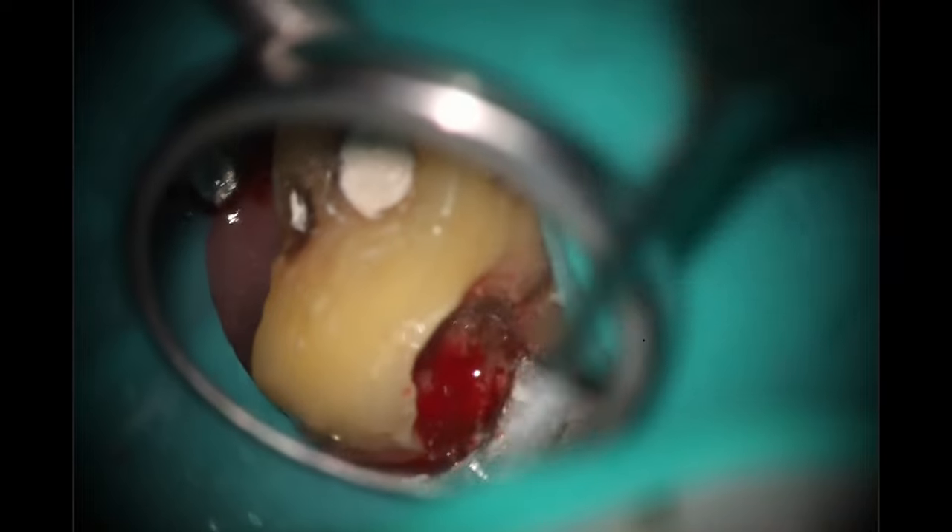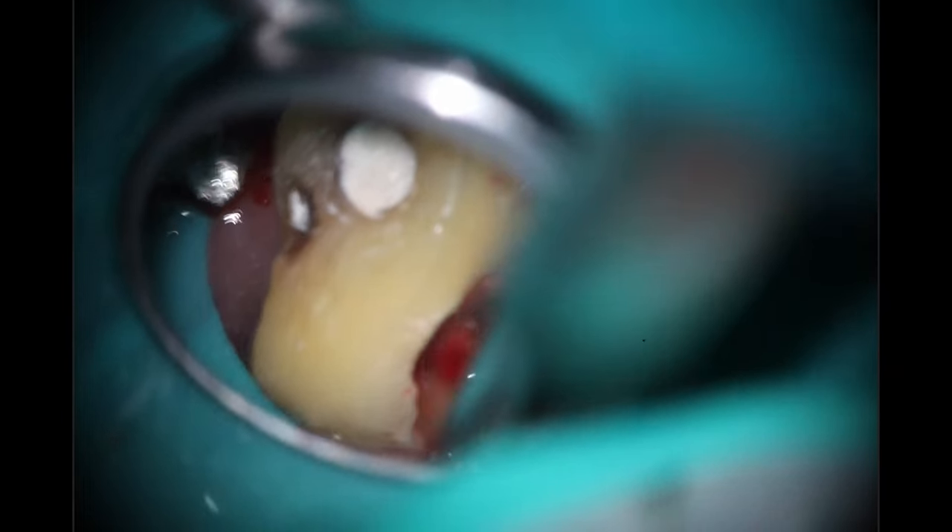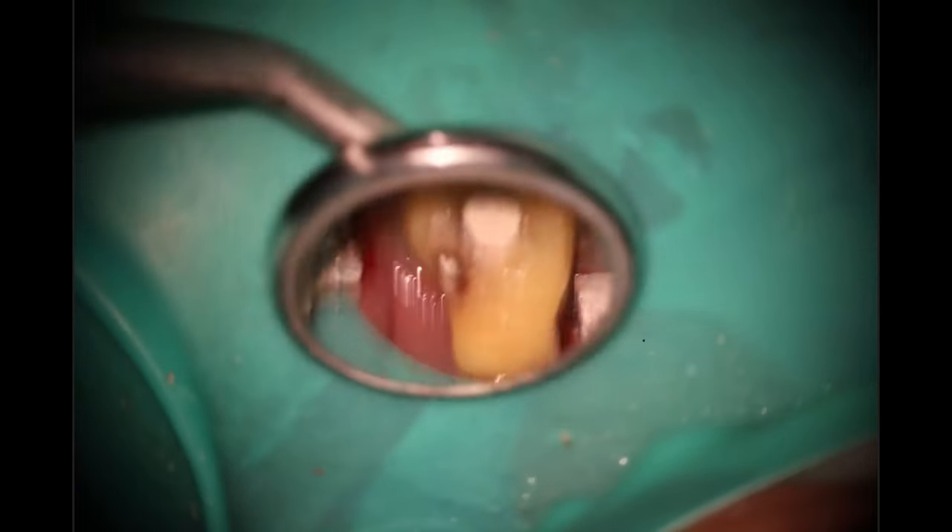You can tell this tooth was not hurting her yet, but it was about to based on that amount of blood — that's actually not from the gingiva. You can see it bleeding right there as well. Just kind of getting that cleaned out. I'm going to go back in with my endo explorer here to make sure all the decay is out, and it's looking pretty good on the occlusal aspect.